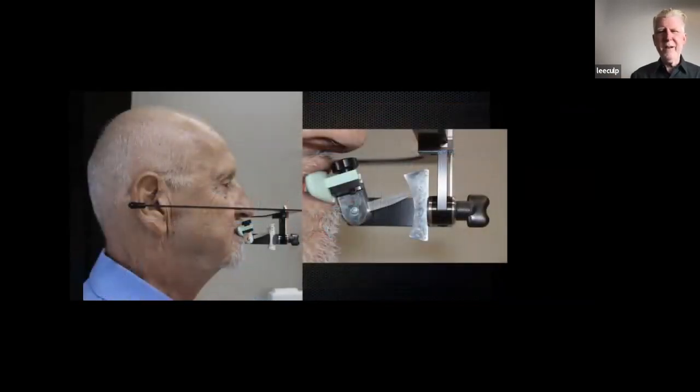So it's basically kind of an occlusal plane. And you can see we have the kind of triple tray in the mouth. We've got everything hooked to the face bow or plane. We're looking at it both from the side functionally for the plane, and then from the facial for the aesthetic plane.